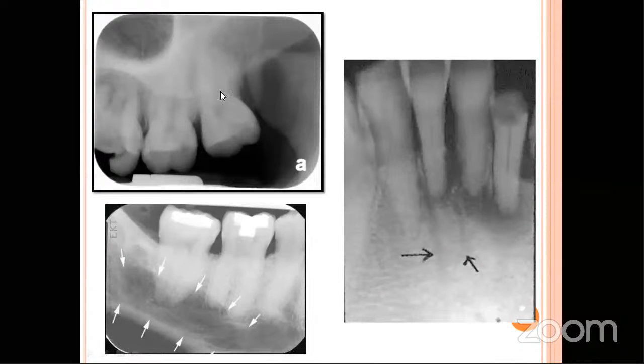So these are all the picture-based images. There was one question asking what is the structure of the mandible, a part of the mandible which is seen in the maxillary IOPA. It is actually the coronoid process. Okay. And what are the radiolucent structures which are seen in between the roots of the anteriors, when the patient doesn't have any history of fracture? They look like fracture lines, what are these lines, they had asked. It is actually nutrient canals.